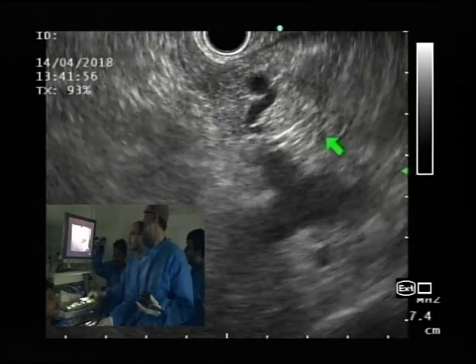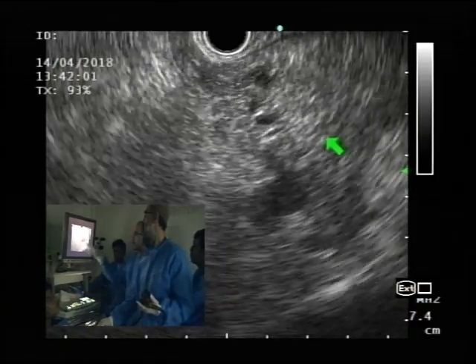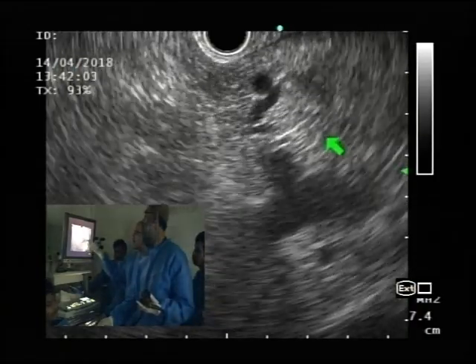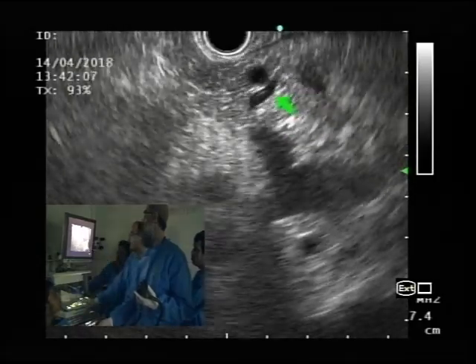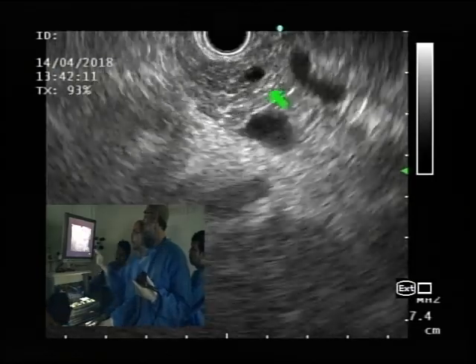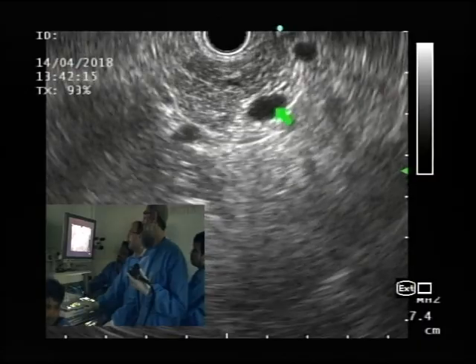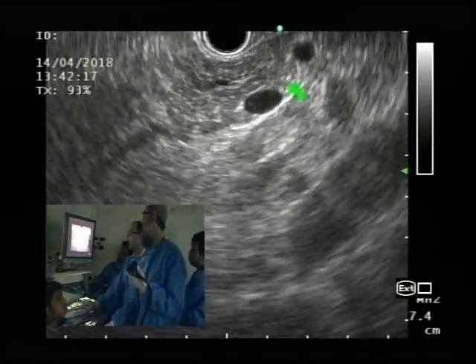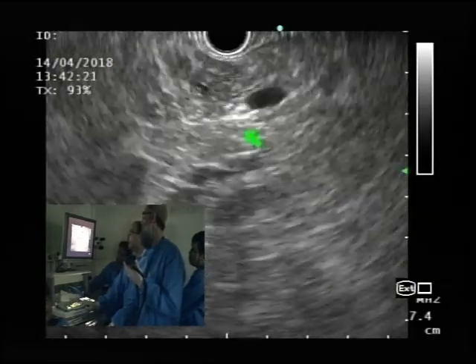So we are in the body still, looking at the pancreatic duct, and Nadim's going to demonstrate for you the duct going towards the body tail. So this is obviously our pancreatic duct. So go clockwise and you will see the duct going towards. There's the splenic artery, splenic vein, pancreatic duct, and we're following it clockwise towards the tail of the pancreas.